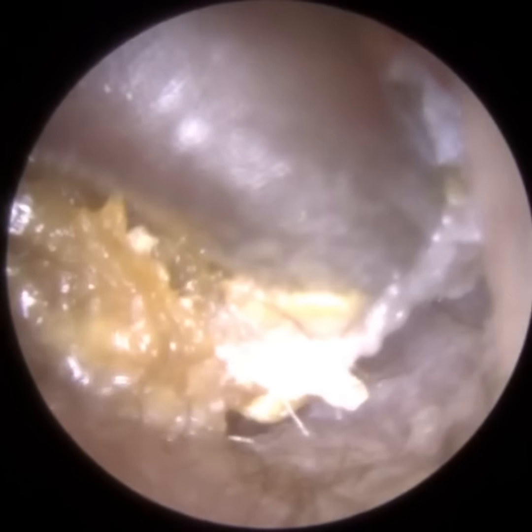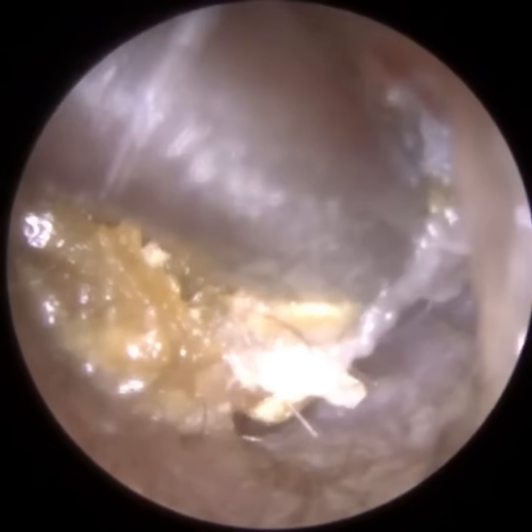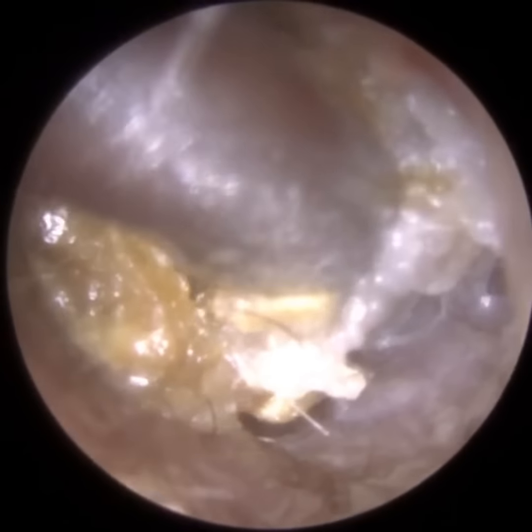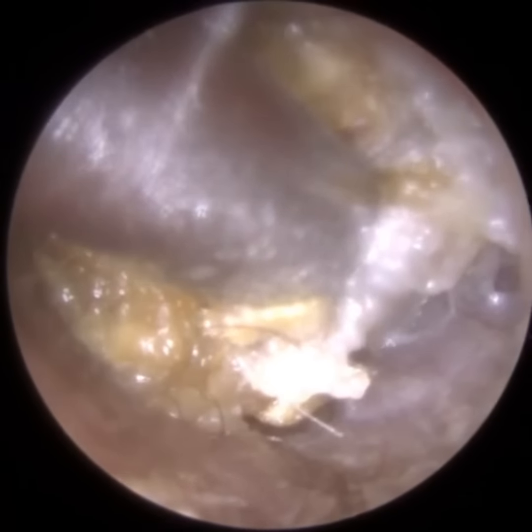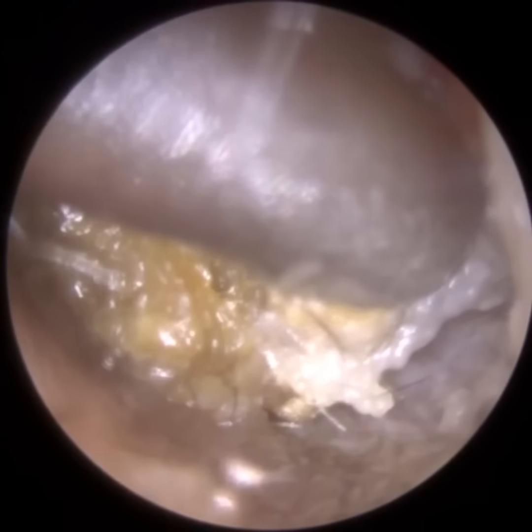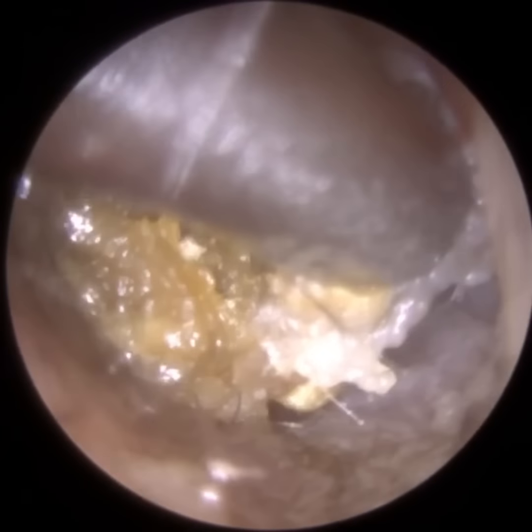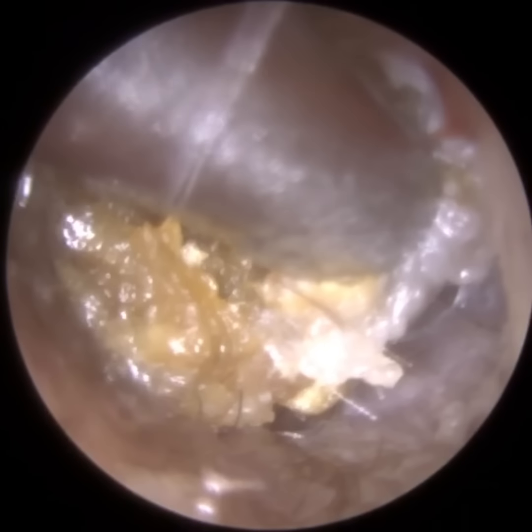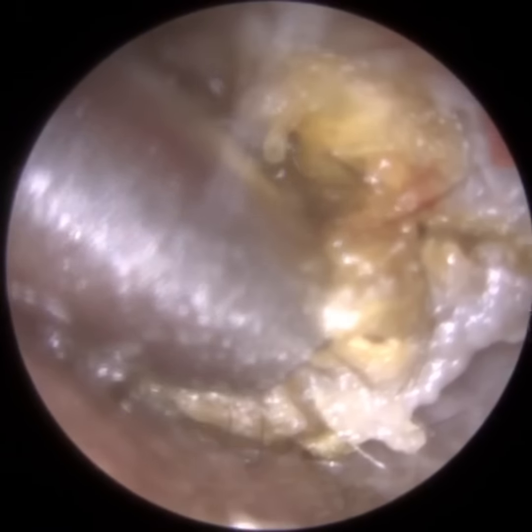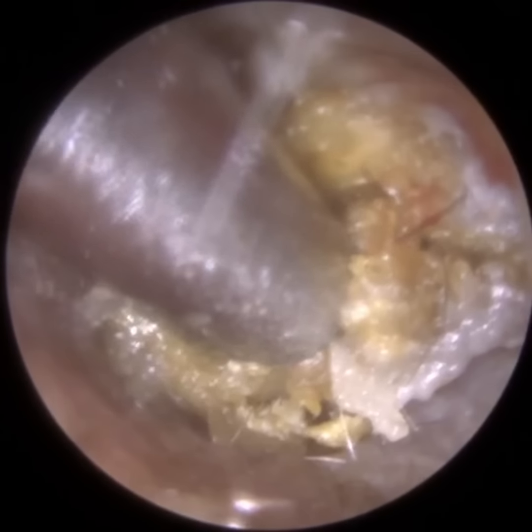And as soon as we opened the clinic this morning, we had a phone call, and we managed to get him in as an emergency today. And so I'm really tugging away at it. So in a moment, we're going to use hooks and forceps. It's always a bit difficult introducing hooks and forceps deep into the ear because you just want to avoid making contact with the bony part of the ear canal, because it will be very uncomfortable for the patient. But we had no other choice really.